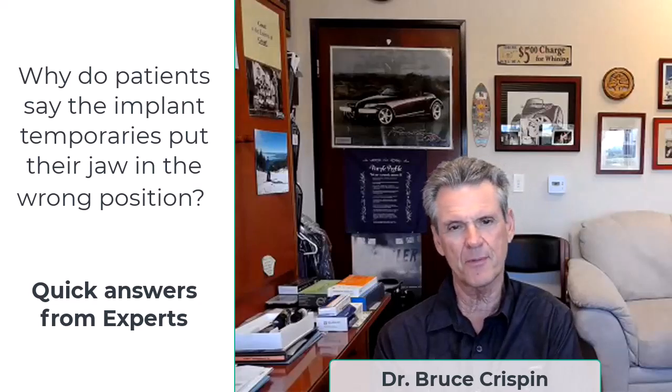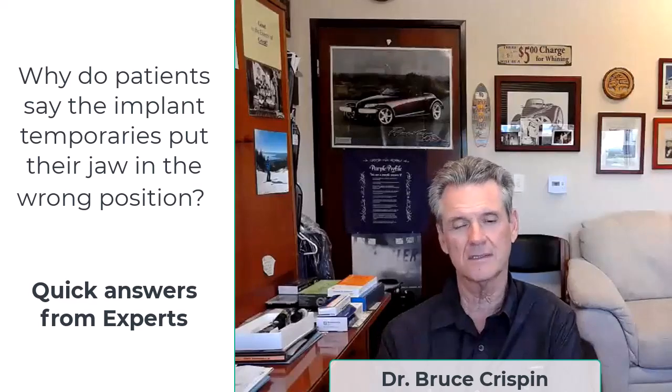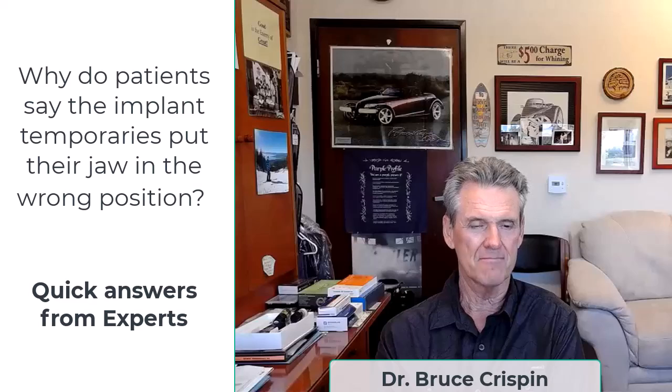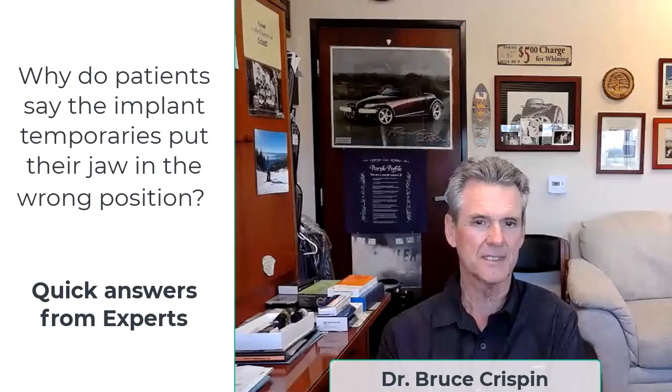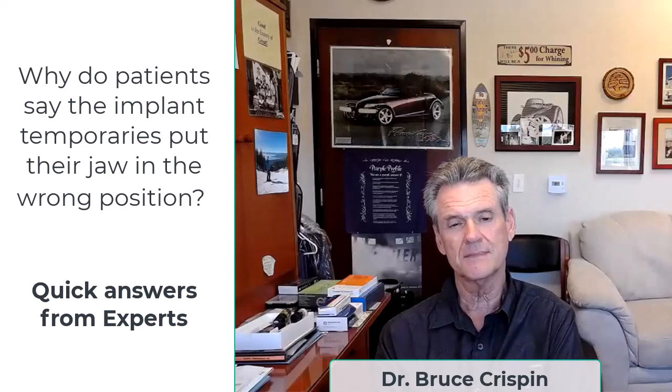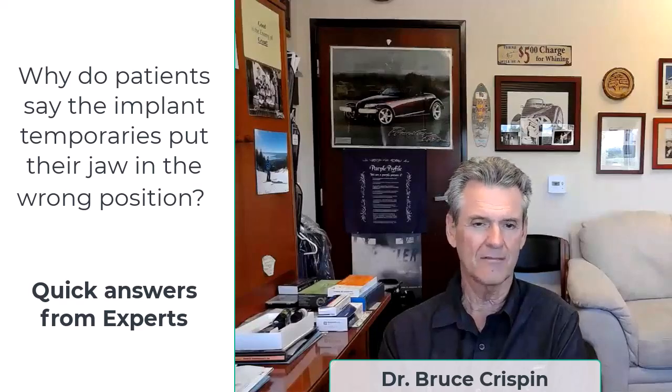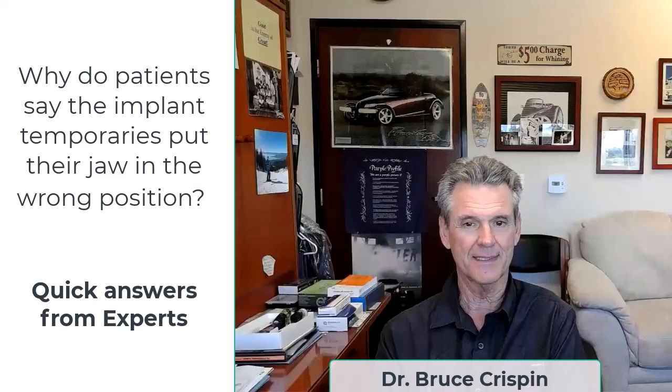Usually when patients complain about their bite being in the wrong position, they're a pretty good indication of what's right and what's wrong. And anytime you're dealing with entire arches, if you get the wrong interocclusal registration or the lab builds things that aren't the way you want them, a lot of times maybe the bite is off. And some people can adapt to almost anything. Some patients are very keen on their bite. I call it really having an acute occlusal awareness.